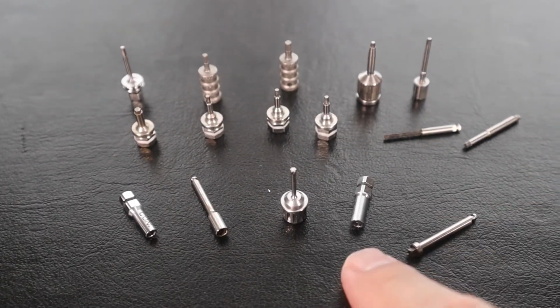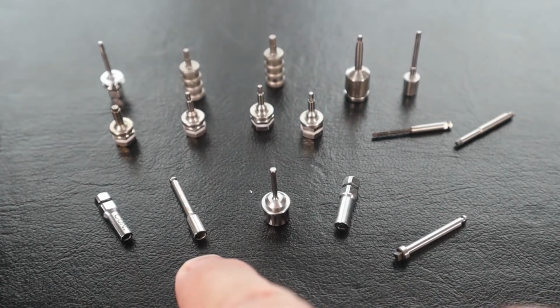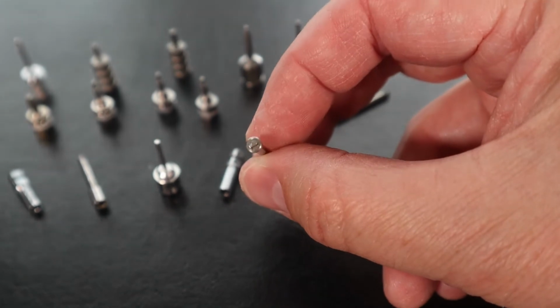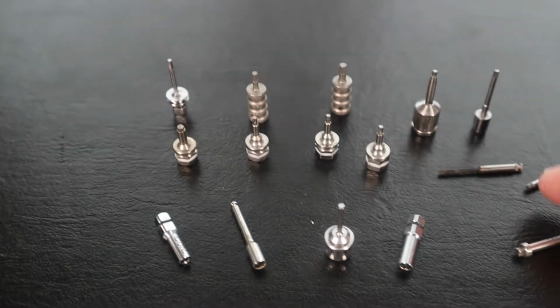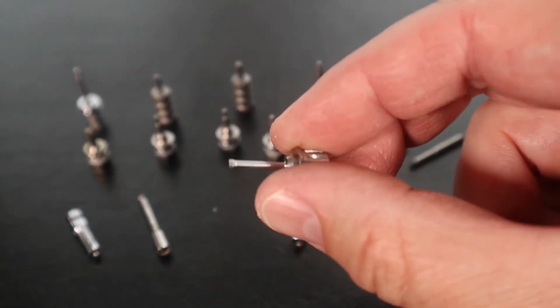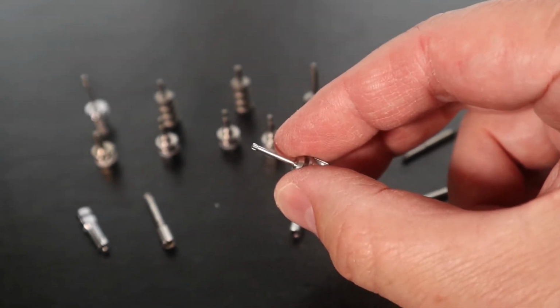On the bottom, I have some socket style drivers. These aren't used as much anymore. We still use them though for overdenture attachments. Actually, that's what this triangular shaped one is. That works pretty well for one brand of attachments. There's other brands too that come in different shapes. And then this one is a proprietary driver that I just got for a brand of implants. It's almost like a Torx head, but a little bit more rounded.